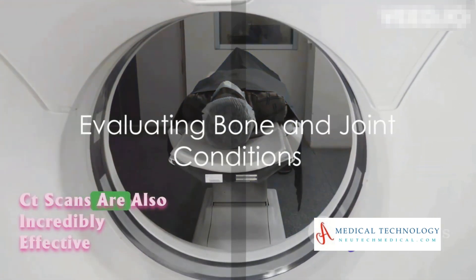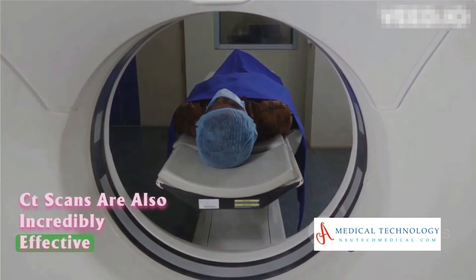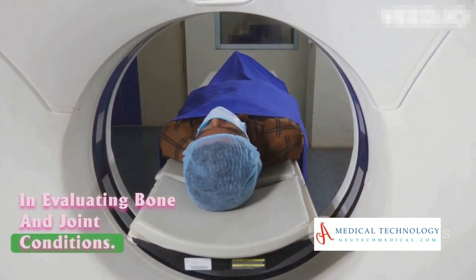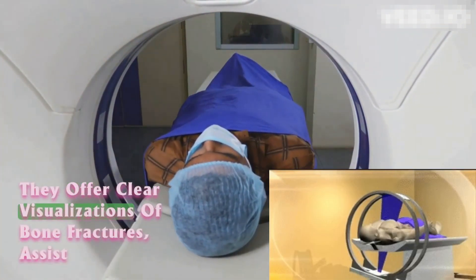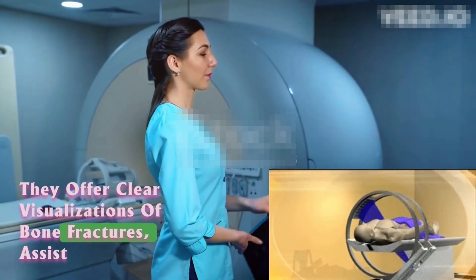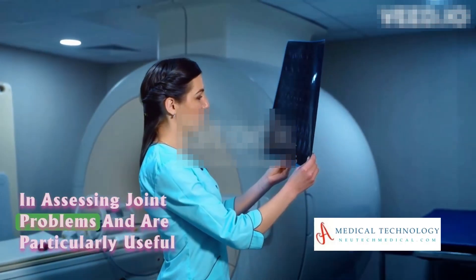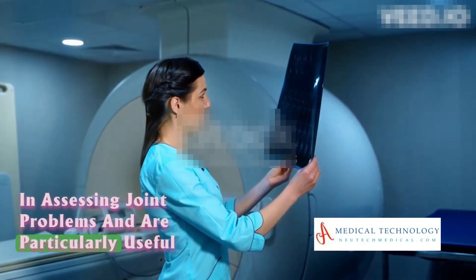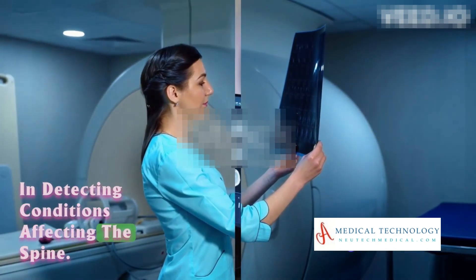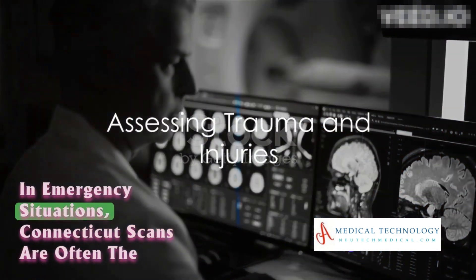CT scans are also incredibly effective in evaluating bone and joint conditions. They offer clear visualizations of bone fractures, assist in assessing joint problems, and are particularly useful in detecting conditions affecting the spine.